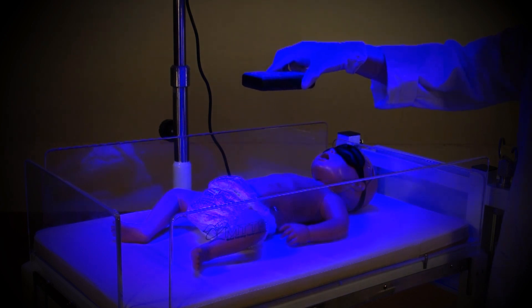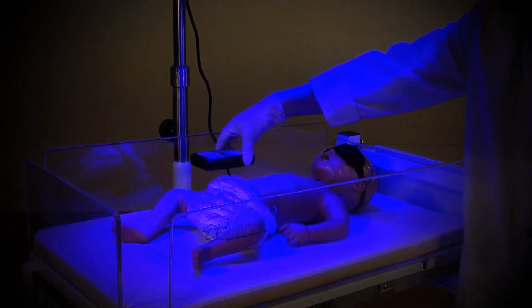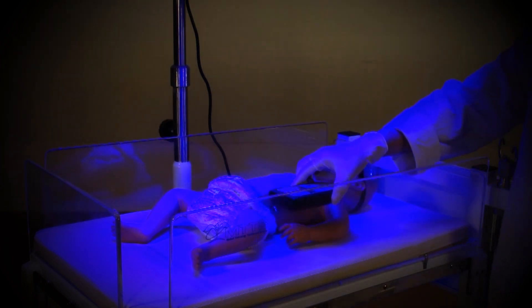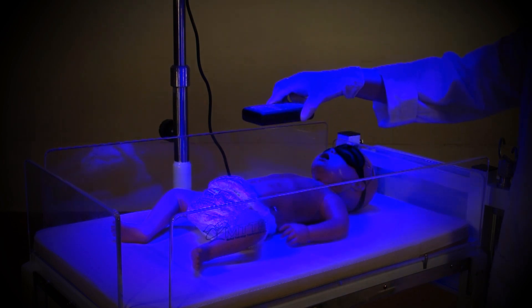The light meter can be used to measure the intensity of any type of phototherapy device, including single-sided and double-sided machines. Here you see the light meter in use with the MTTS overhead phototherapy V3000 and with the double-sided phototherapy the Firefly.